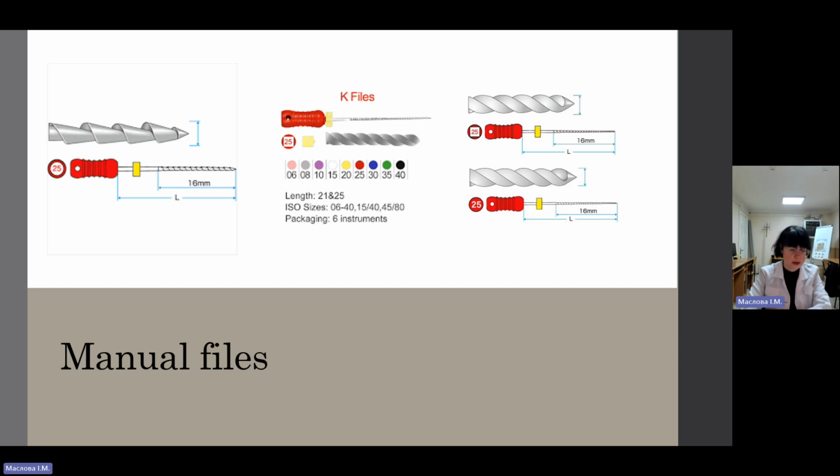You can see on the screen the endodontic instruments which are K-type, and endodontic instruments which are H-type, or H-file, or Hedstrom file. K-file: this file is so named as it was introduced by the Kerr company. These files are made like reamers, by twisting a triangular or square blank, but in a series of spirals to produce from 0.9 to 1.9 cutting edges per millimeter length. They will work either in a reaming or a push and pull filing motion.